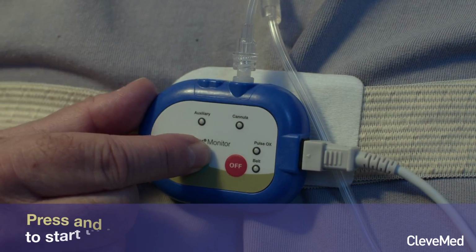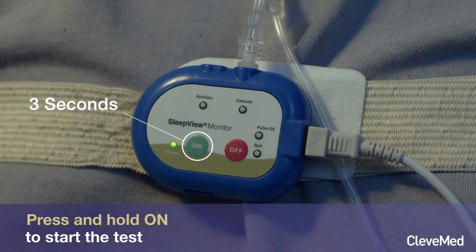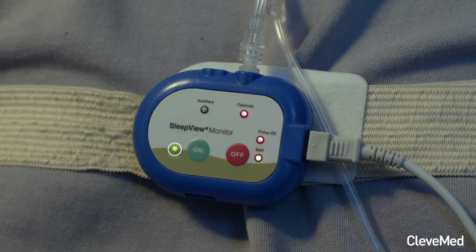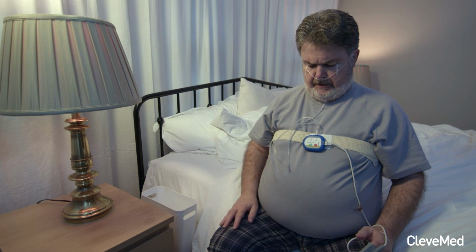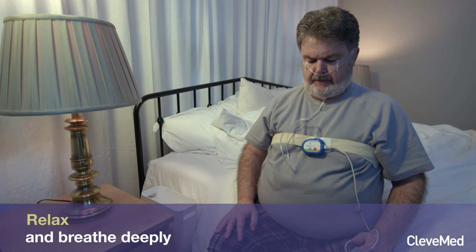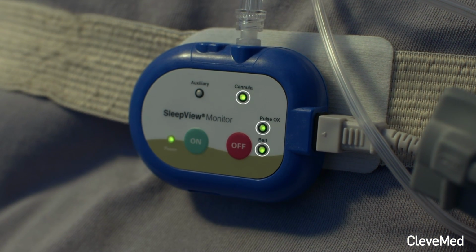Press and hold the On button, located in the front of the SleepView Monitor, for 3 seconds. The power light should turn green. Once the monitor is on, relax and take a few slow, deep breaths. Eventually, the lights for each sensor will turn green.